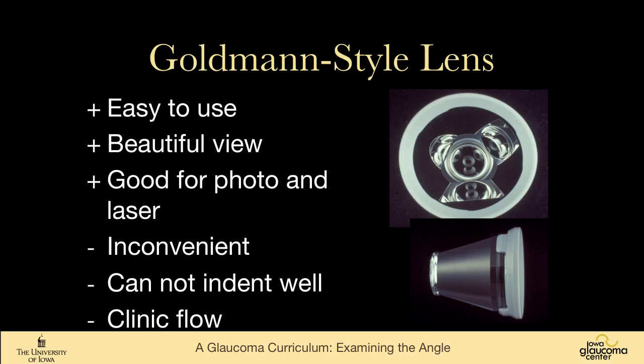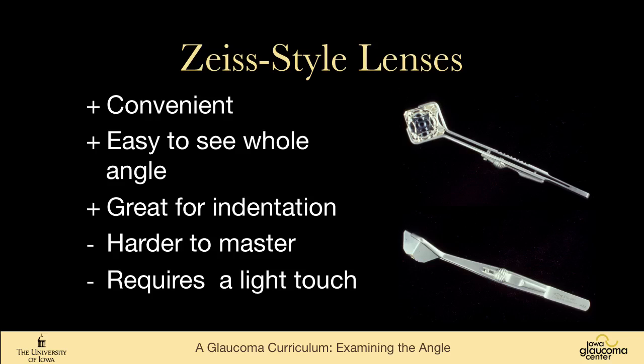And to me, they really interrupt my clinic flow, because I normally would do gonioscopy before visual fields, before the dilated exam, and any kind of imaging or photography, and the methyl cellulose from the lens really messes with all those things. So I don't use it routinely, but I use them quite often. Of the 3 mirrors in the prototypical Goldmann lens, it's the shortest mirror that points towards the angle.